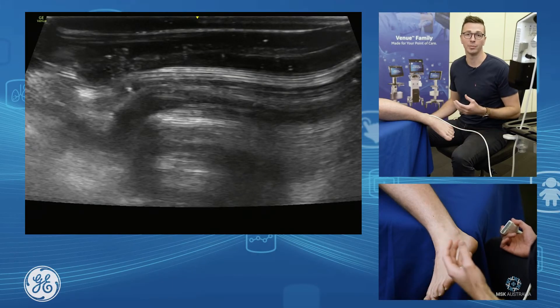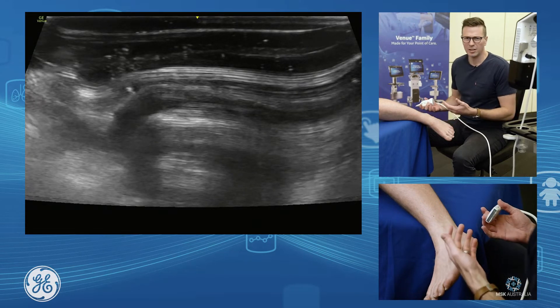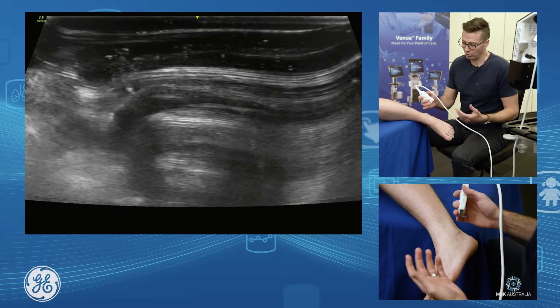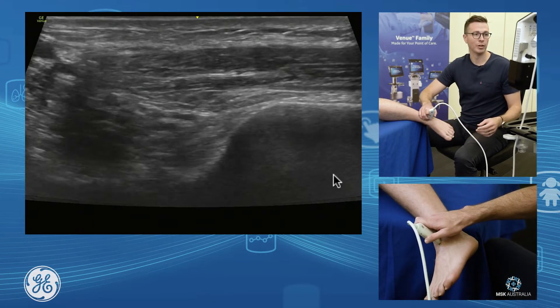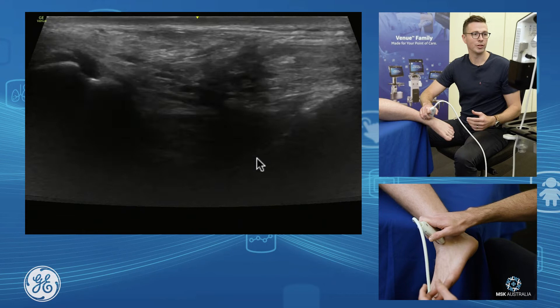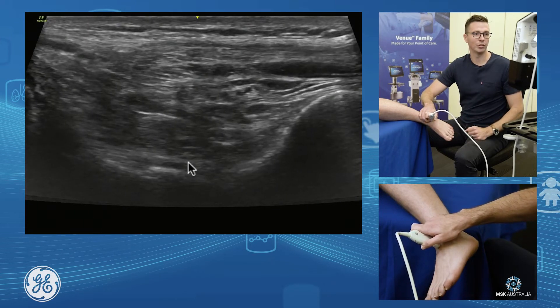Now we're going to discuss the assessment of the anterior ankle joint and the subtalar joint. The anterior ankle joint is a very easy joint to assess. Find your tibia, grab your probe, put your probe on the front, find the front of your tibia, go down off your tibia onto your talus, and through here we see our anterior joint.